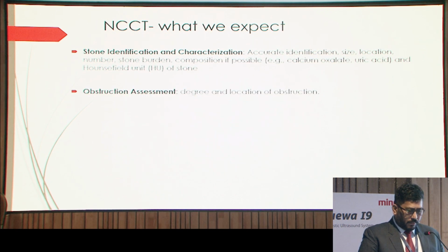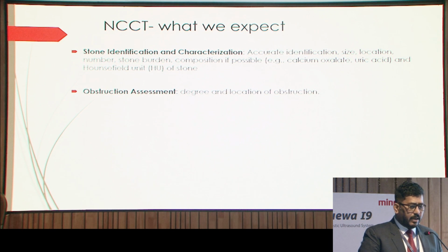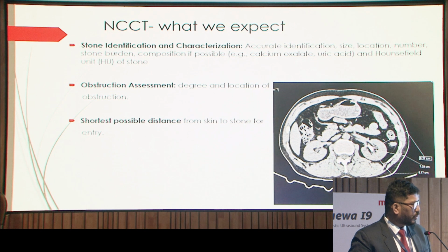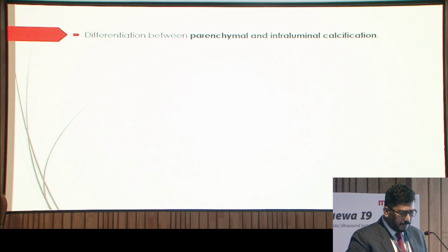So, next is obstruction assessment. Degree and location of the obstruction should be mentioned. Then shortest possible distance, which has already been covered. Shortest possible distance from the skin to stone should be mentioned to decide the treatment. Then hydronephrosis, I have already mentioned in USG.